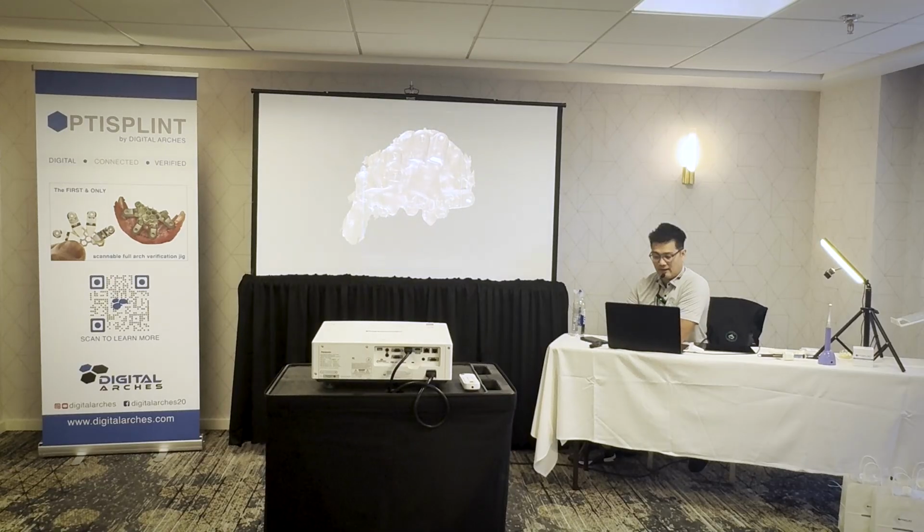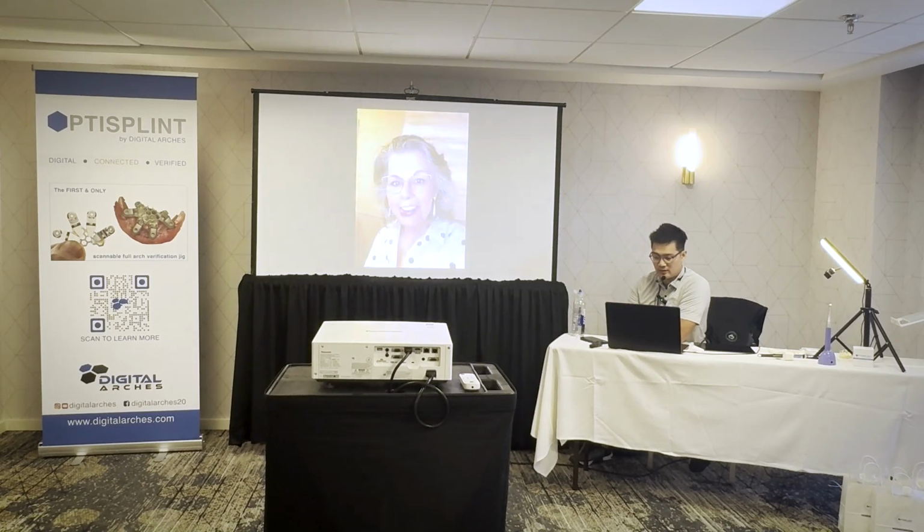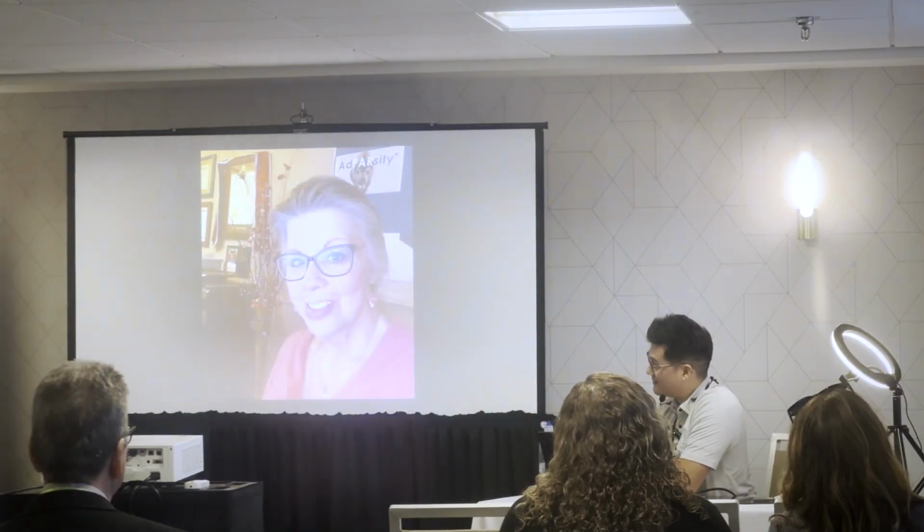She saw Dr. Bray on Friday, and he was able to do the OPTISPLINT, scan it all, and pick it up in the mouth. Then on Friday, I designed it, I milled it, and we sintered it over the weekend. I came in Monday morning, I stacked the case, and this was her Monday evening with her final zirconia.